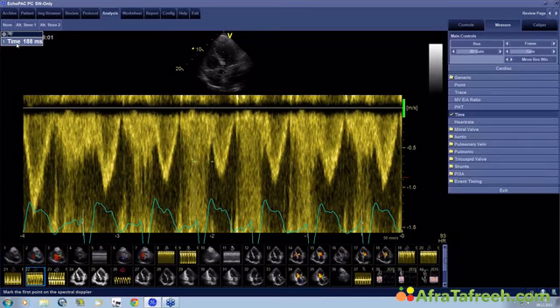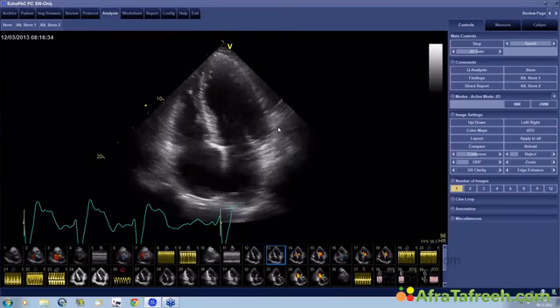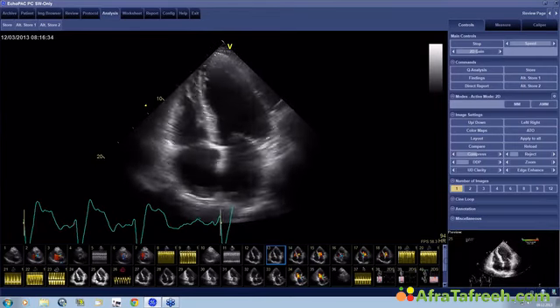And if you compare this measurement to the measurement we performed before, and you subtract the two, in other words, you take 188 and subtract 117, you get something like 71 milliseconds, the difference between the two. And the cutoff value here is 40. Everything that is more than 40 speaks for desynchrony. So what do we have here? We have a patient where we clearly see that there is desynchrony, where the measurements fit quite nicely.